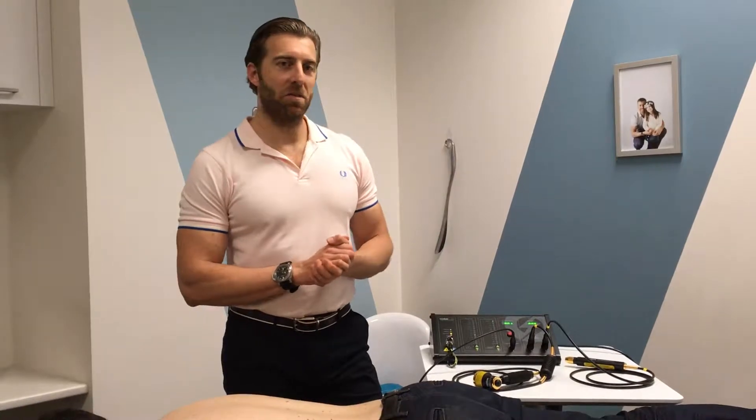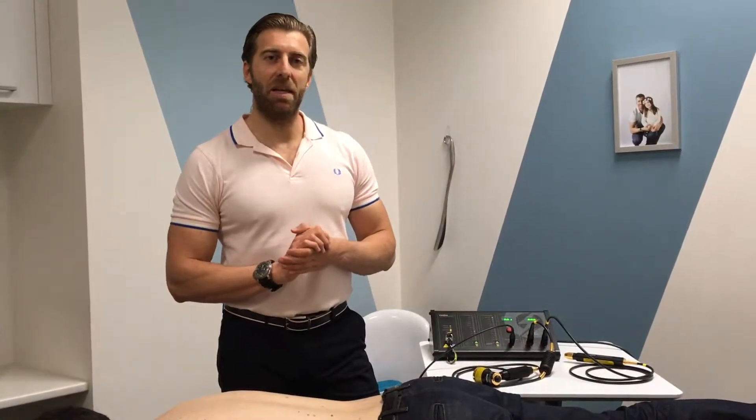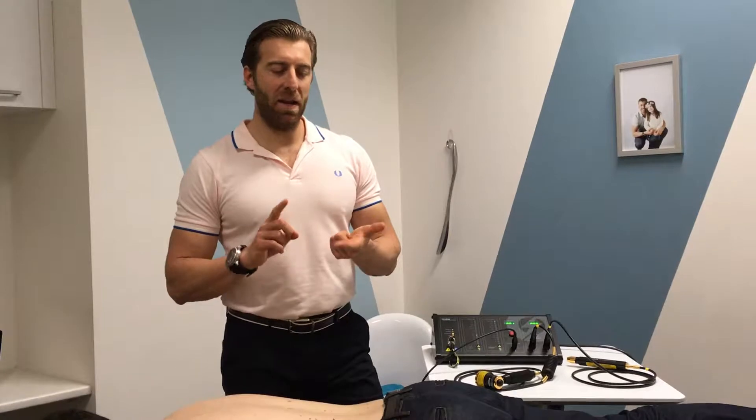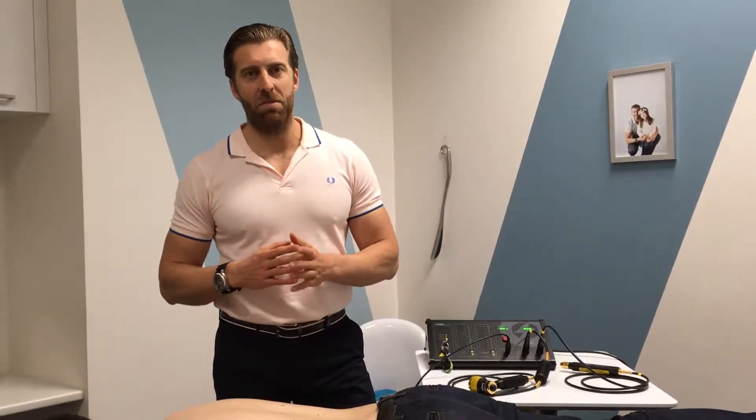Today I'm going to be demonstrating the treatment of acute or chronic back pain with the use of cold laser therapy. Cold laser therapy is also known as PBMT, which stands for photobiomodulation technique — photo meaning light, bio meaning life, and modulation meaning to inhibit or stimulate. So we would be inhibiting pain or stimulating tissue repair, and oftentimes both.